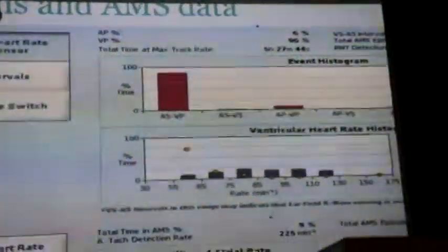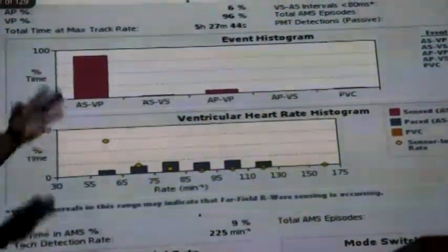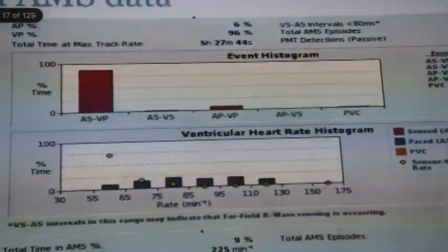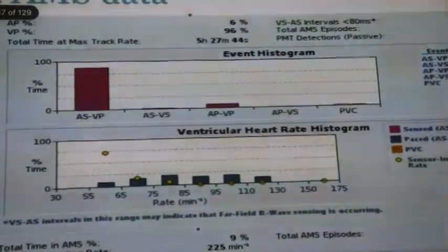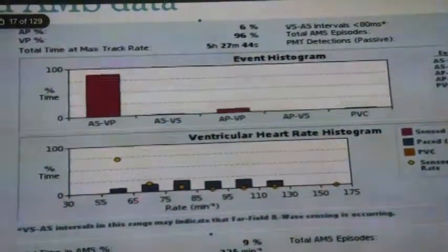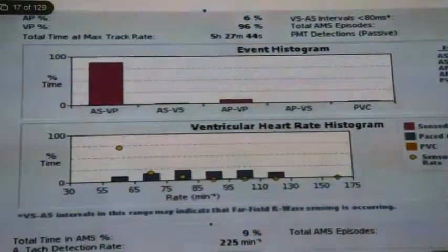Sorry. So any comments on that? It says ventricular, there's atrial. There is no column with the average heart rate between 70 and 80, but all are going the same. Yeah. The guy doesn't have any high heart rate. No, he does. He goes up to 130. Remember, this is a heart failure patient.